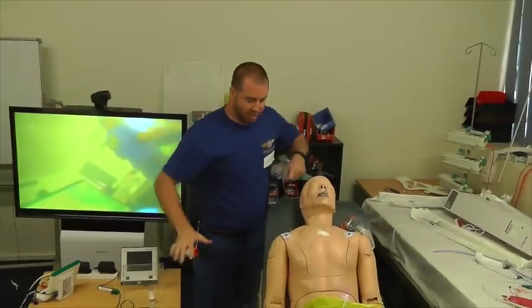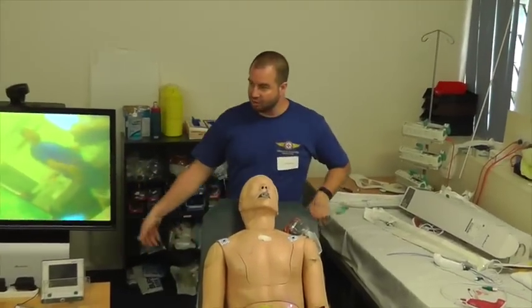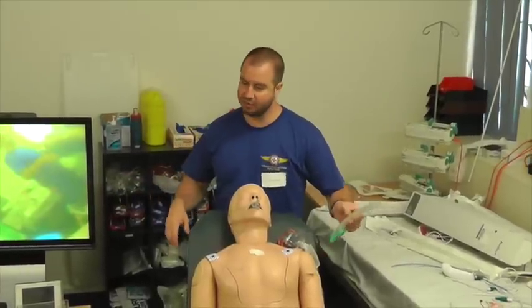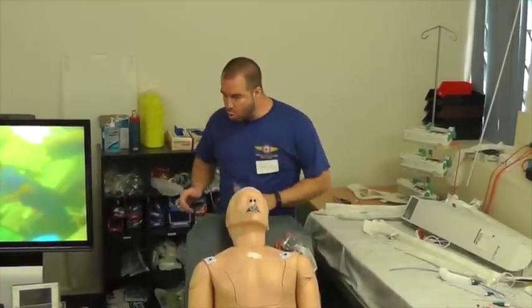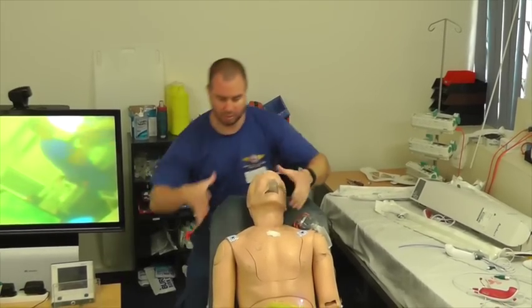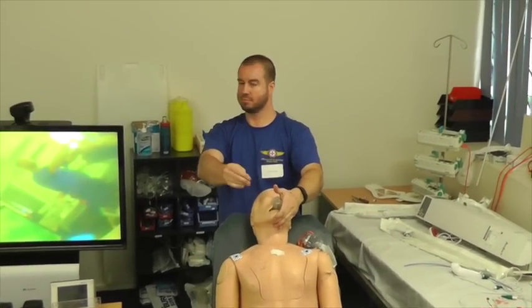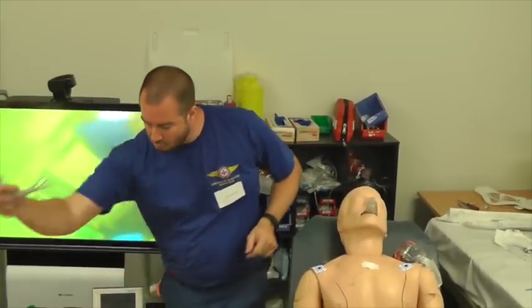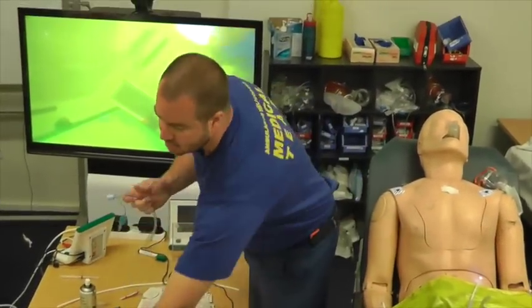So you've got to get to that point where you've got your plan and your kit ready and your drugs ready and your scope prepared and your ergonomics and your furniture set, and you've got to go, because this is the oral lumen that you're going to use, not what they have in place.